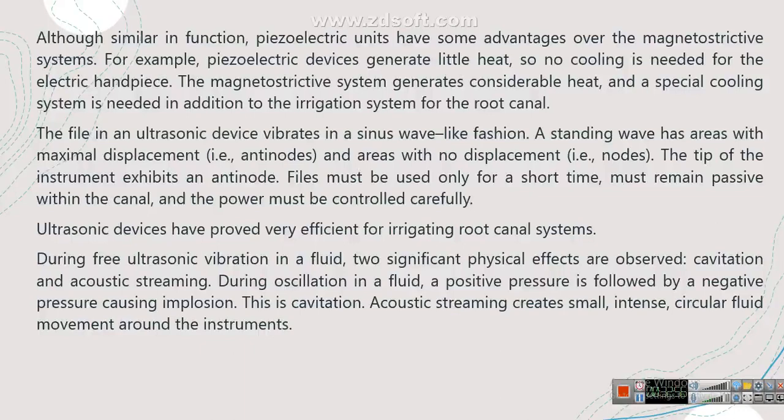So when we are using ultrasonics, we have to use them with good caution and for a short period of time, and not manipulate the instrument within the canal system too much, because the tip of the file may damage the walls, and sometimes it may cause ledge formation.